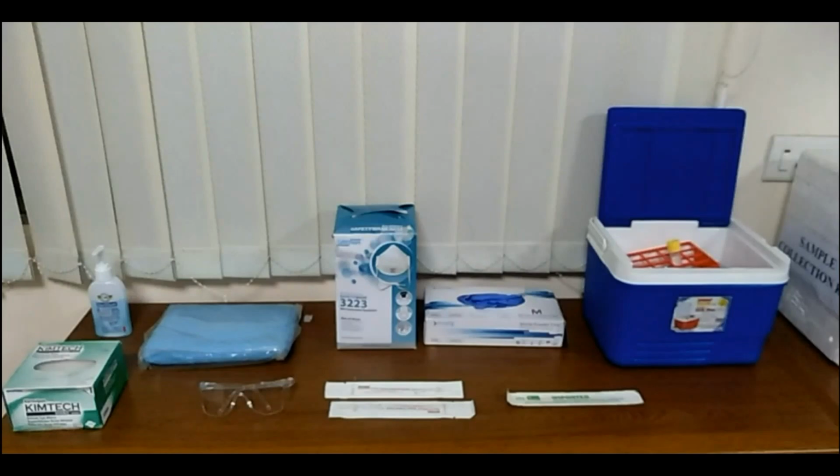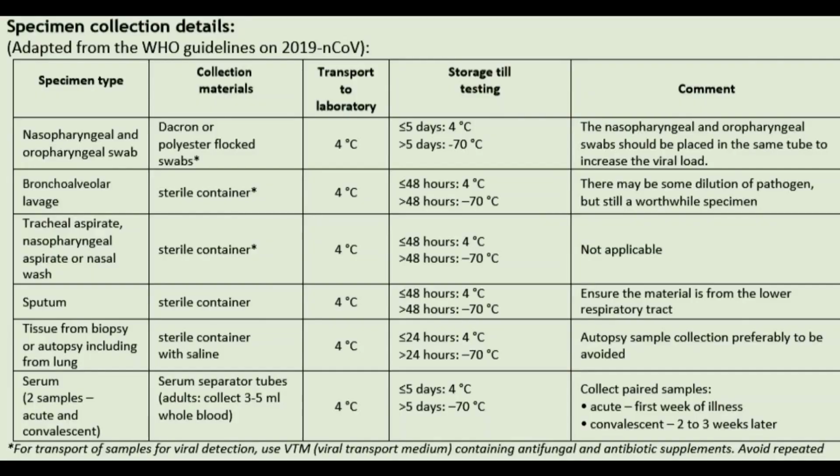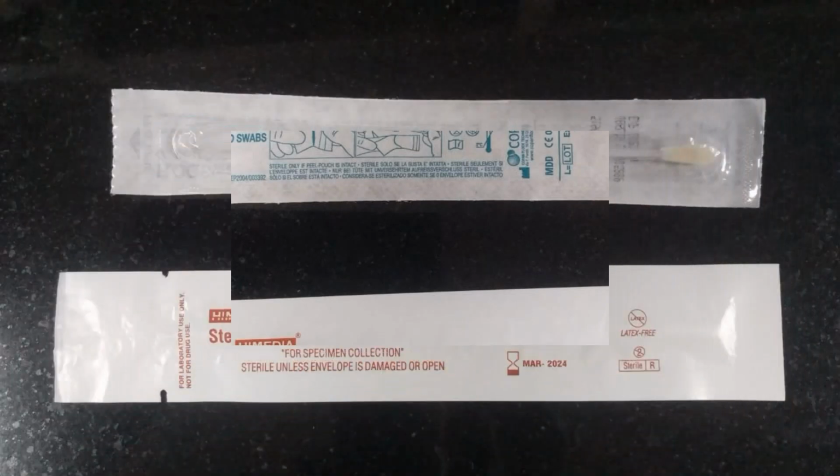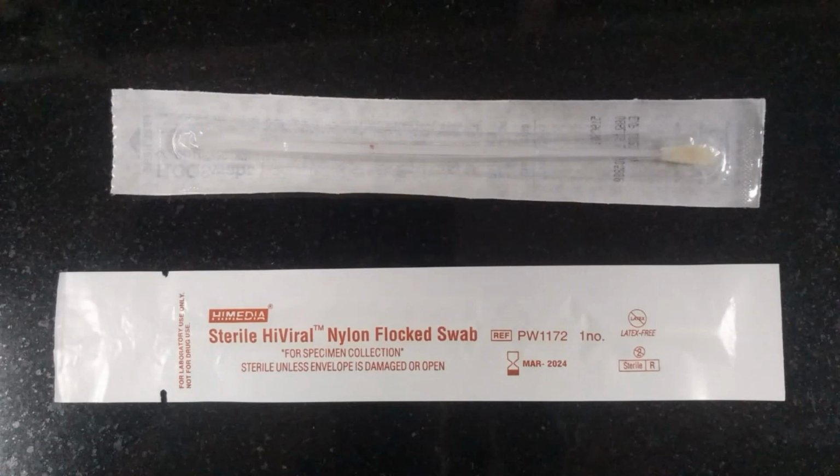Arrange all the material prior to sample collection. Make sure you have the correct type of swab, that is, only Dacron or rayon swabs with plastic shafts or flocked swabs should be used. Do not use cotton or calcium alginate swabs or swabs with wooden sticks, as they may contain substances that could potentially inactivate or inhibit some viruses or adversely affect some molecular tests.